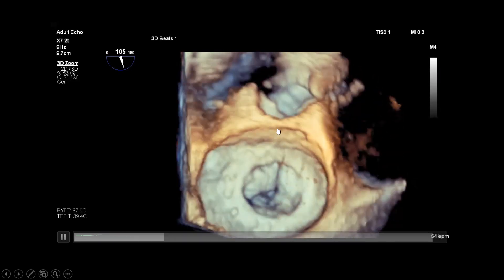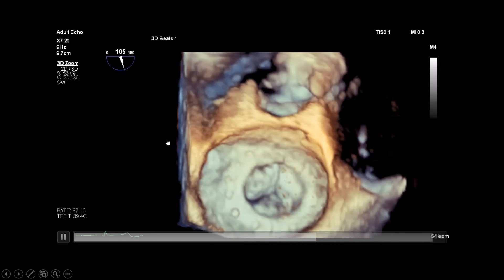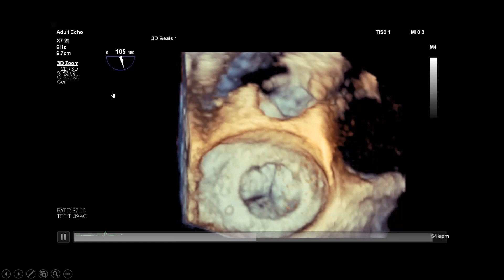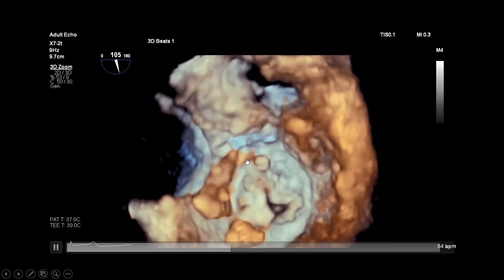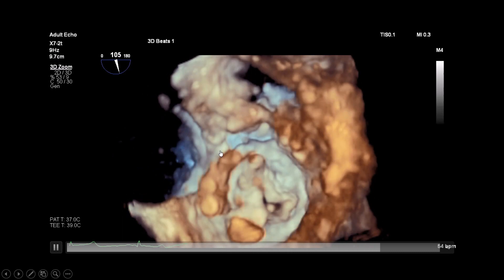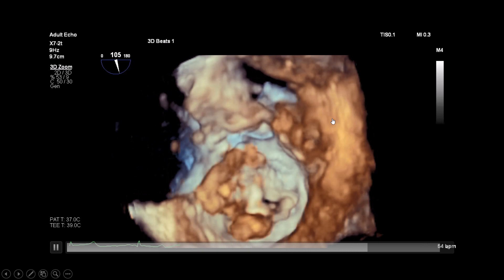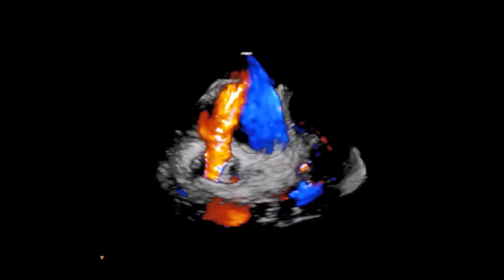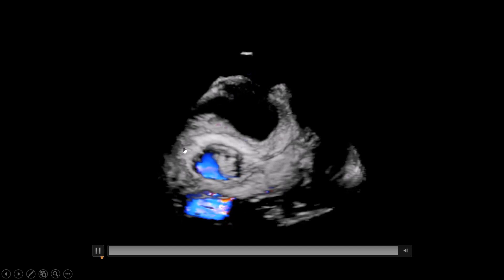The interatrial septum is here, so the right atrium is in that direction, and the left atrial appendage is under the coumadin ridge. There is a very tiny opening in diastole for the mitral bioprosthesis. Flipping that over to look at the mitral valve from the left ventricular aspect in short axis, you can again see the three cusps of the mitral bioprosthesis opening very tightly, which explains why the mitral valve is severely stenotic.